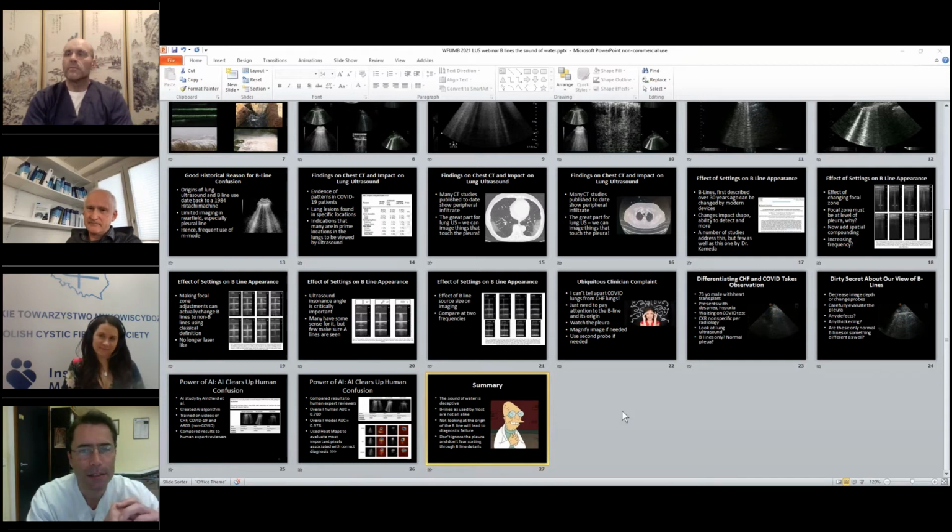Okay. And just to reinforce what Michael said, the score might be useful. I'm not sure whether it works, but I know that it happens that patients are admitted from the emergency department because of some ultrasound findings. This might help to decide whether a patient is better sent home or admitted.